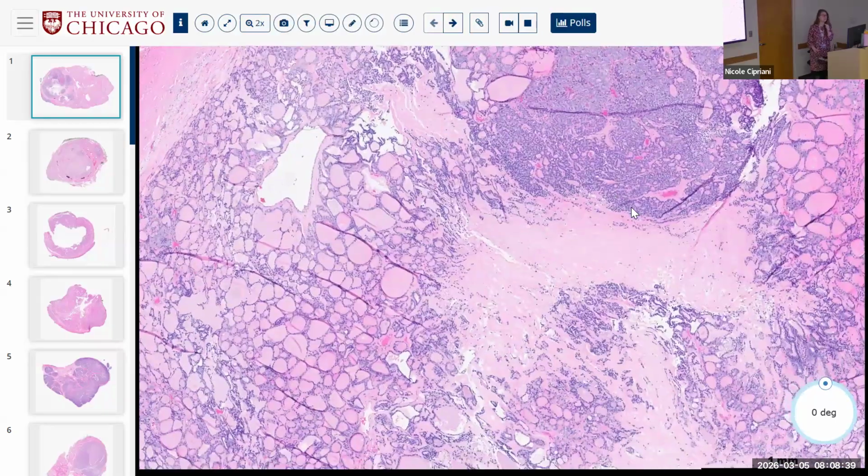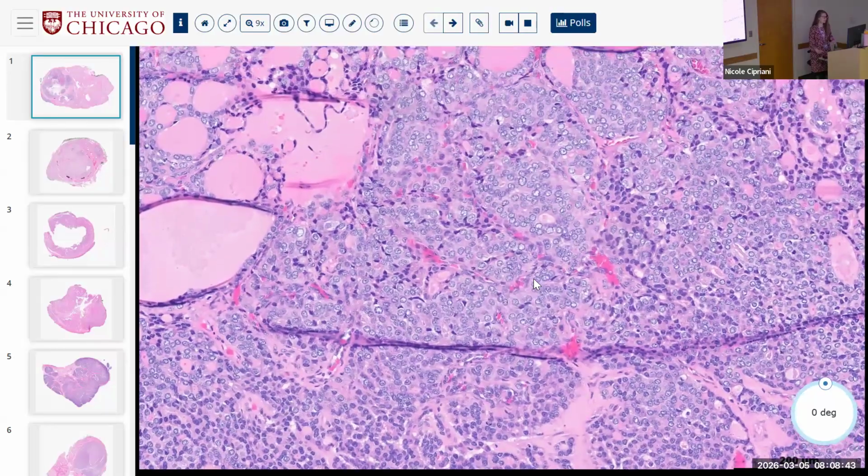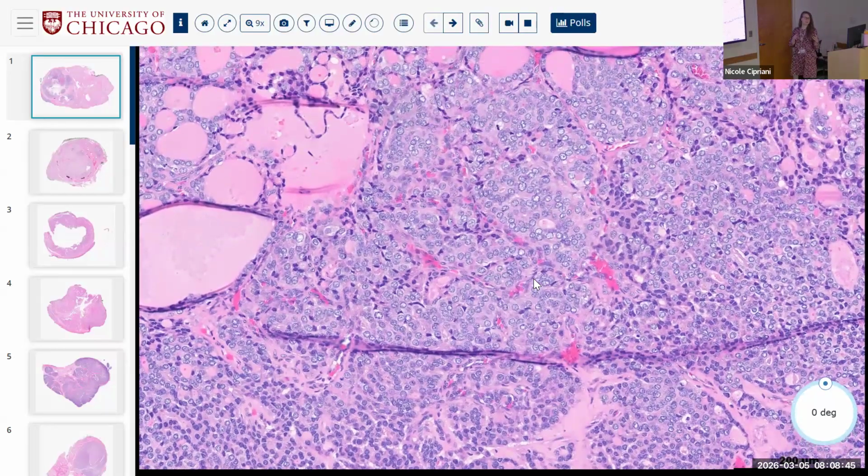All right, so true tumor necrosis, high grade. Mitotic activity, 3, 4, 5, there are different cutoffs for different tumors. We'll talk about that, but 3, 4, 5 or more per 10 high-powered fields or 2 millimeters squared, whatever cutoffs you're using. So in this case, I didn't really see it, but always look out for those, okay?